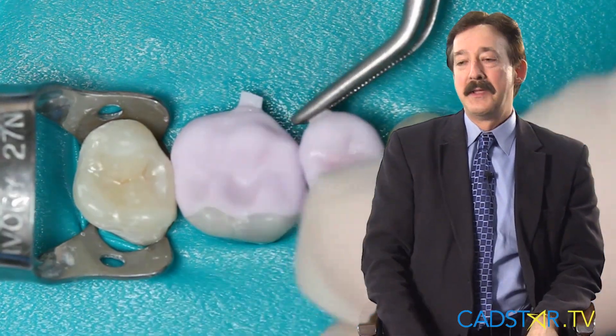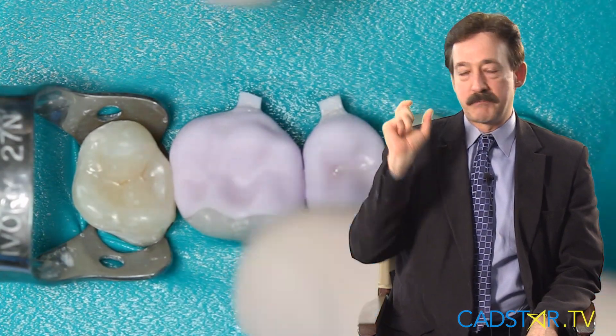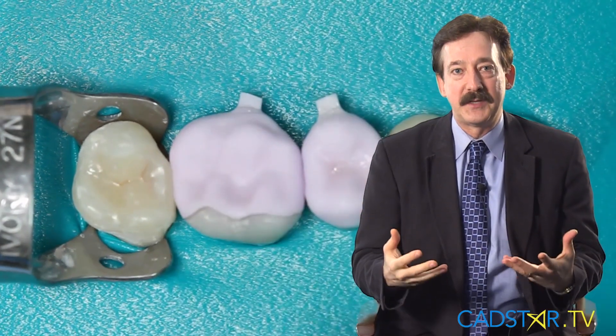That's all about fundamental restorative dentistry, particularly with CEREC — and I did this way before CEREC when I used to use labs. My restorations would come back from the laboratory and just pop right down. I've transferred and continued that process into my CEREC world. Eight out of ten times I'm prepping the teeth next door to optimize my draw — just remember that.